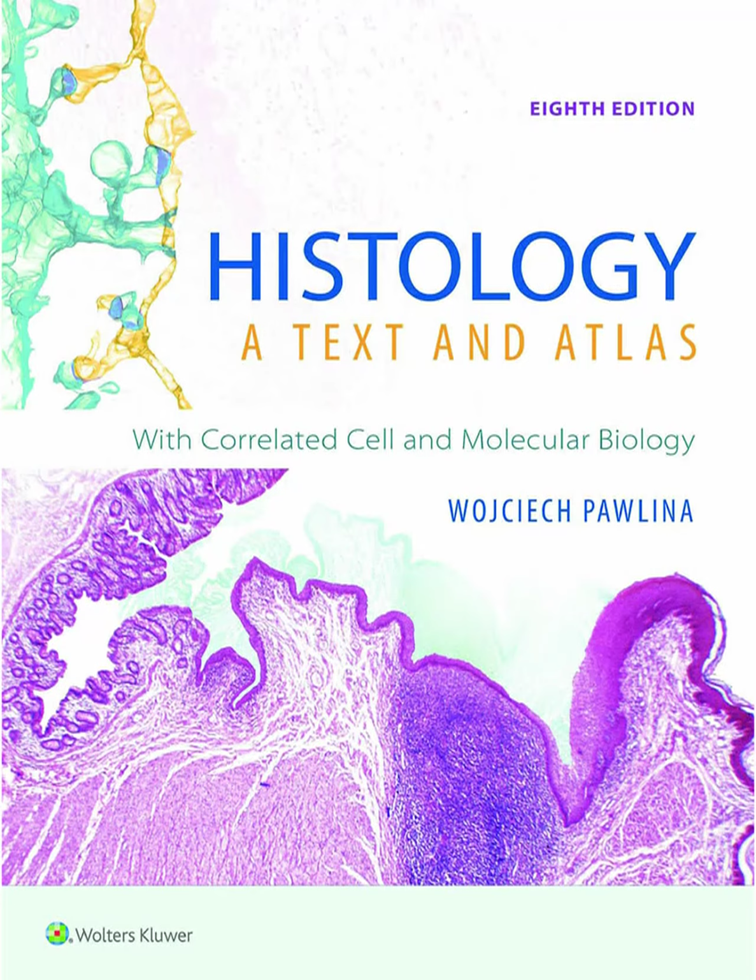We create probes, short sequences of nucleotides that are complementary to the specific DNA or RNA sequence we want to find. These probes are labeled somehow. Like molecular fishing lines with hooks. That's a good analogy. You introduce these probes to the prepared tissue section, and they will hybridize or bind specifically to their complementary target sequence if it's present. How do you see where they've bound?